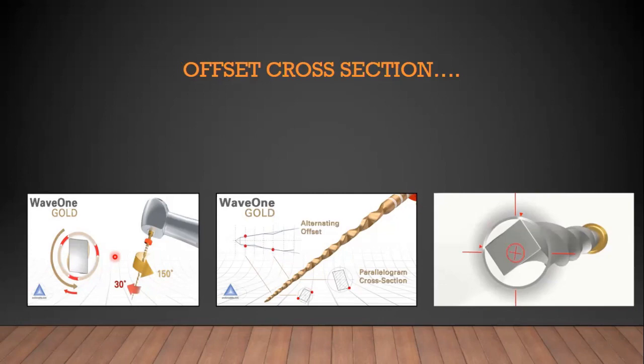During rotary preparation, the contact between the instrument and the dentine creates internal stress in the instrument and a reaction torque in the root dentine. So when we are preparing a canal, at times we feel screwing in forces because of these internal stresses. What are screwing in forces? It is a tactile sensation that the rotary file is being pulled into the canal in the apical direction. If we don't resist it, it will go beyond the apical foramen.